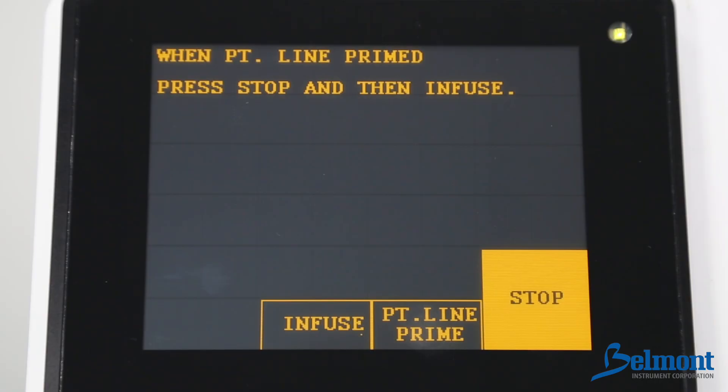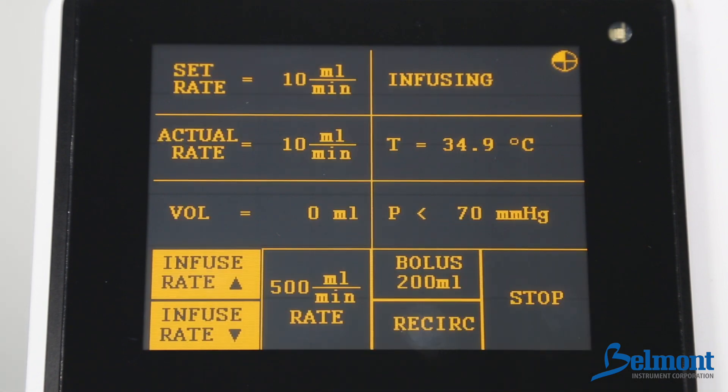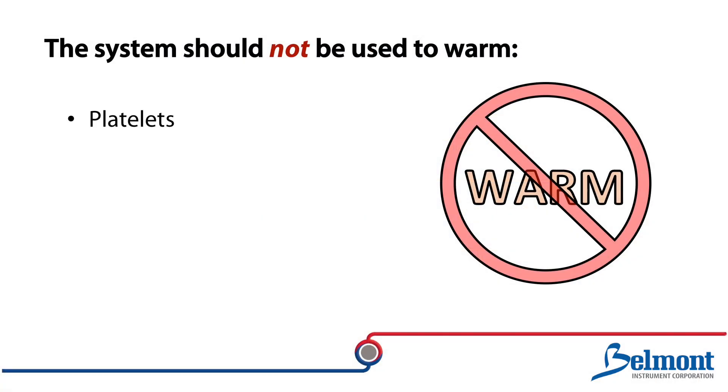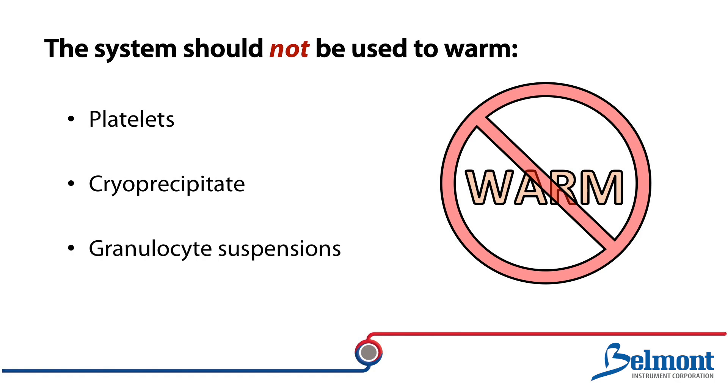Once the system is connected to the patient, press infuse to begin operation. Infusion will automatically start at 10 milliliters per minute. Infusion rate, set rate, total volume infused, temperature of the fluid, and line pressure are continuously displayed. The system should not be used to warm platelets, cryoprecipitates, or granulocyte suspensions.